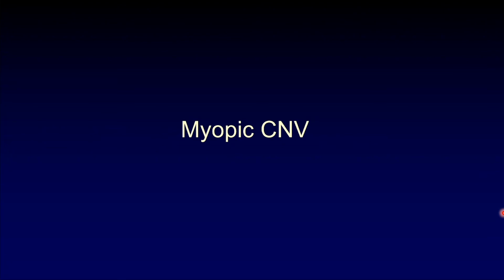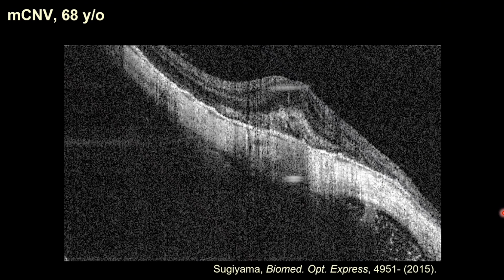By measuring the myopic CNV cases using the Jones matrix OCT, we can observe something we couldn't see by using conventional methods. Okay, here is the retina cross section of the OCT. So there is a choroidal neovascularization here, right? Here is the RPE. But the tissue itself is not that self-evident. But here we see the retinal pigment epithelium, right?